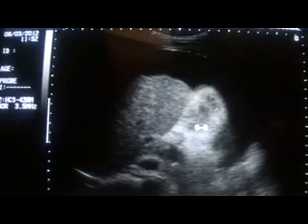Here is the gallbladder, and you can see the gallbladder dancing in the ascitic fluid. This is the gallbladder — small lumen; the tiny cystic area you see is the lumen and the rest is the wall of the gallbladder. This segment shows how the gallbladder wall will appear in massive ascites for any reason; however, in this patient it is because of cirrhosis of the liver.